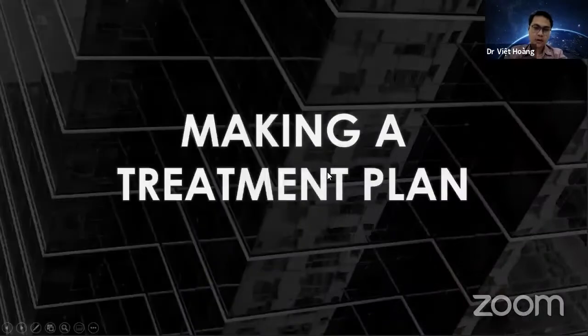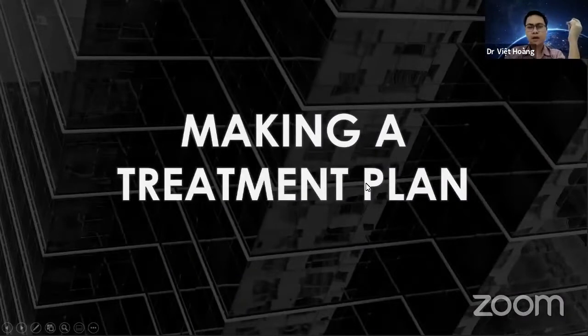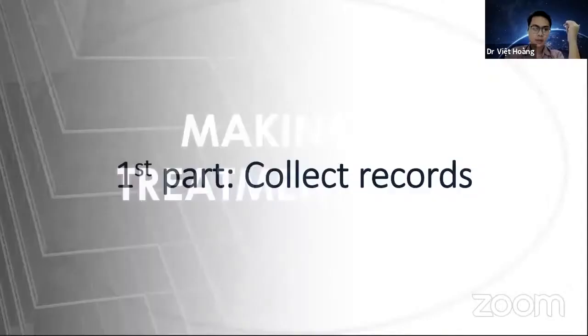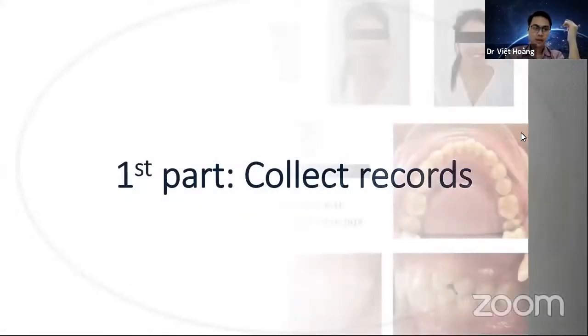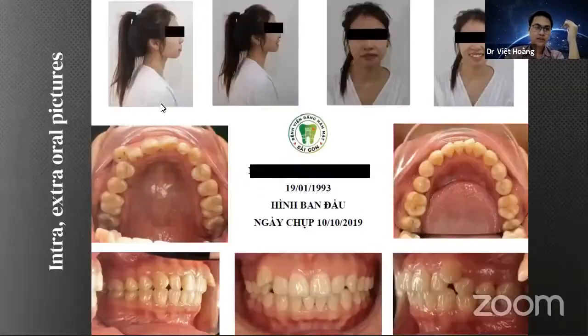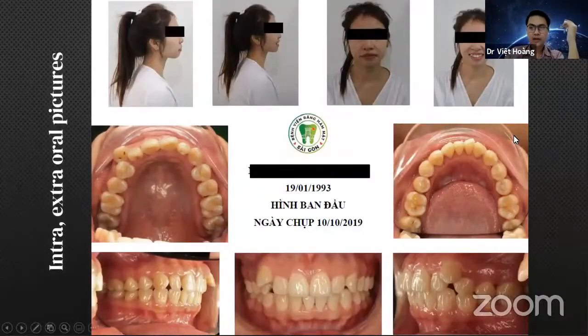First, we talk about making a treatment plan. For making a treatment plan, it has not changed so much from the beginning. The first part, we have to collect the records of the patient. First, intra-extraoral pictures. We can do it easily with a lot of software.